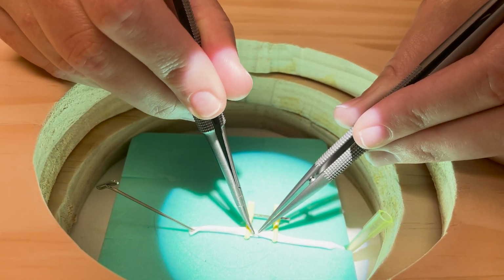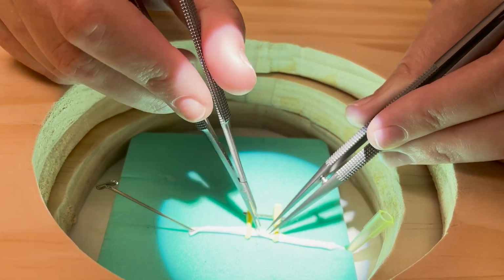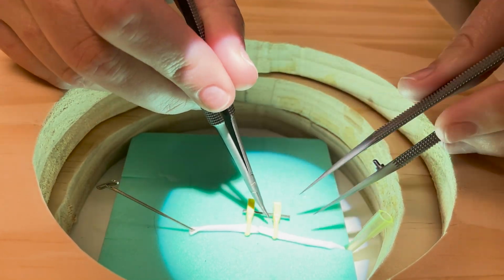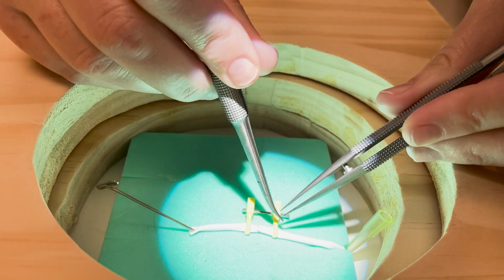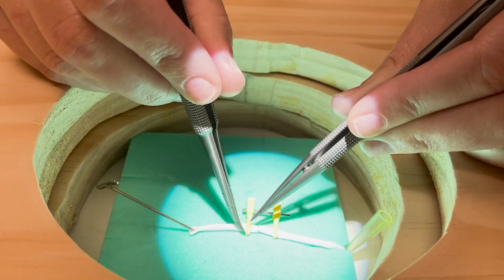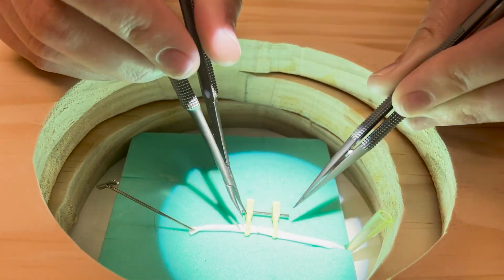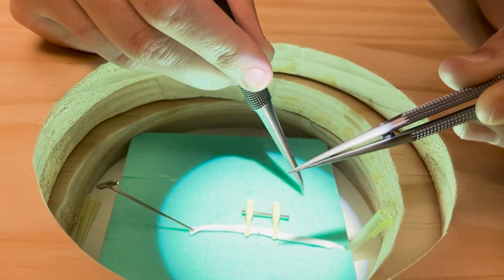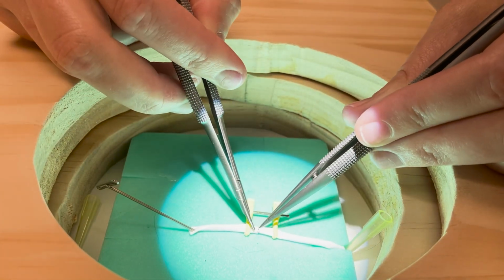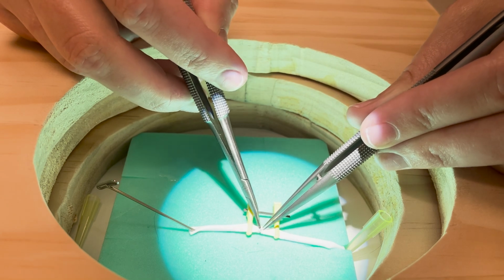The needle is released and regrasped, rotating the needle driver 180 degrees tip down. The curve of the needle is followed, and the vessel should not be elevated from the background. Following the curve of the needle can be difficult with the increased angle of needle driver and forceps. The trainee must focus on rolling the instruments between their fingers to achieve the desired effect.